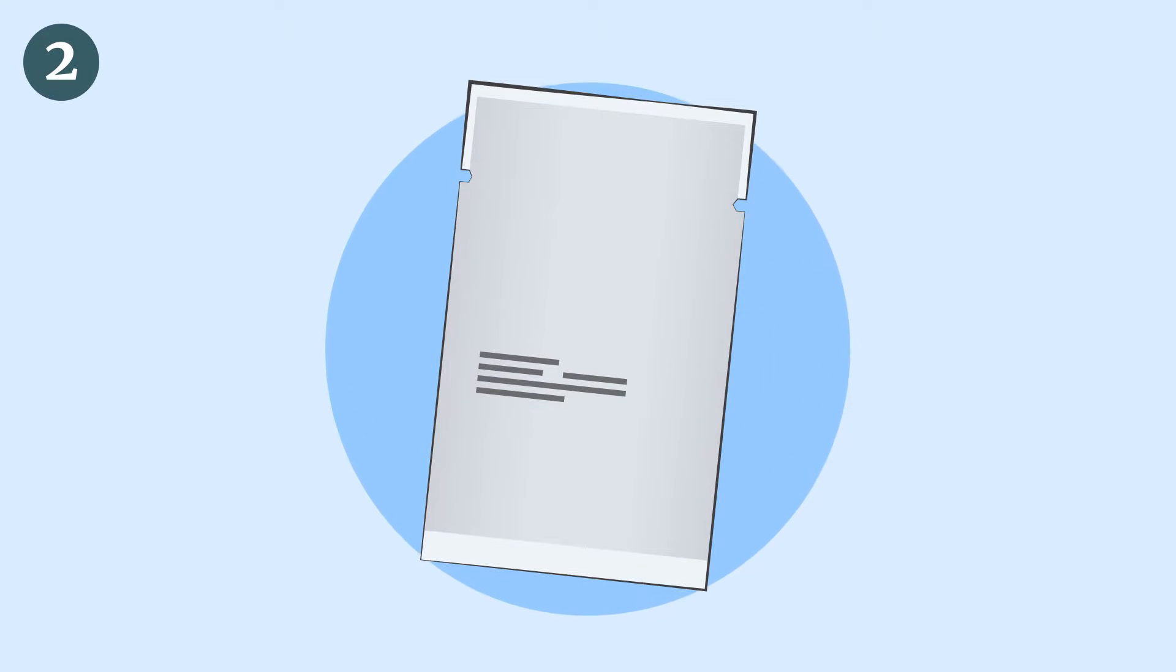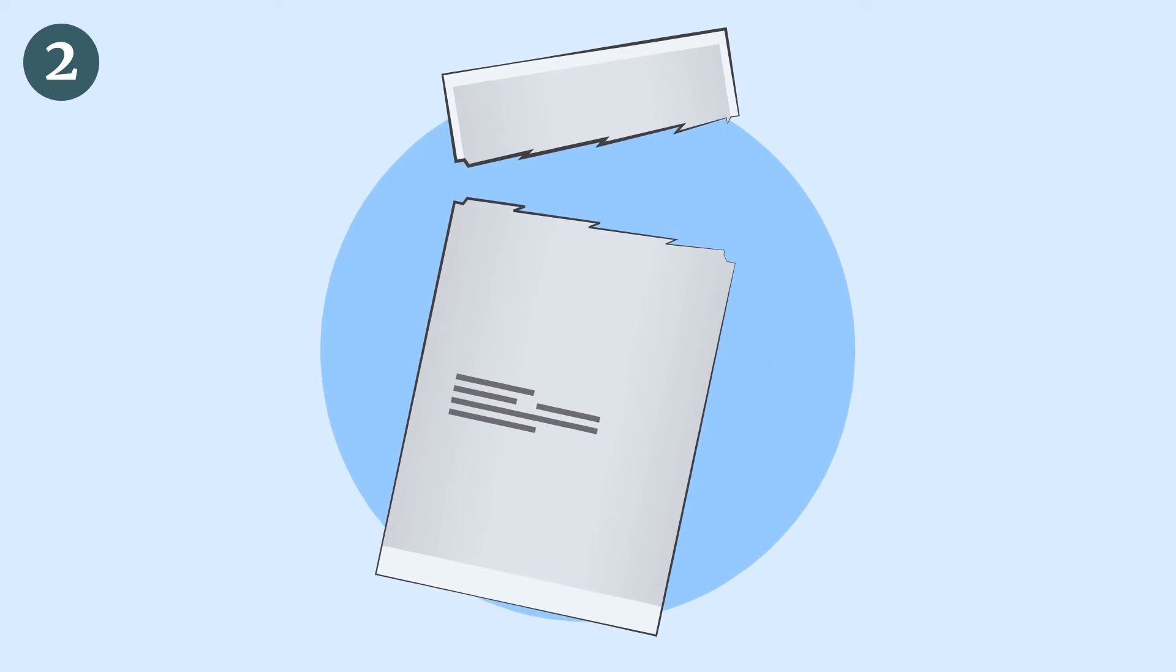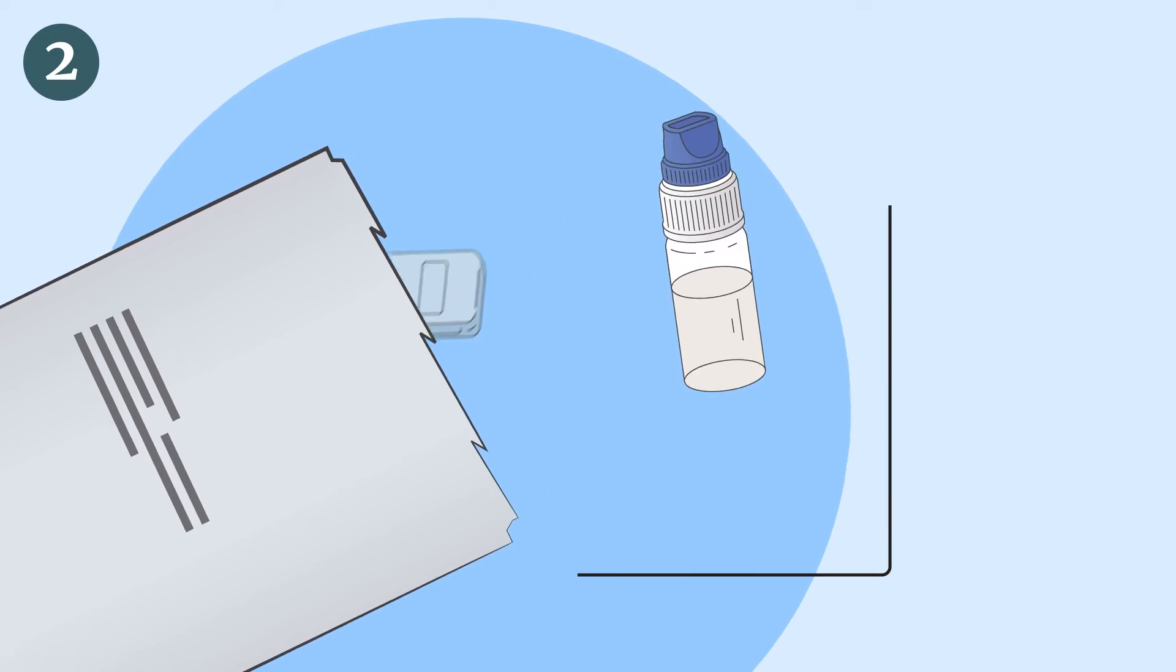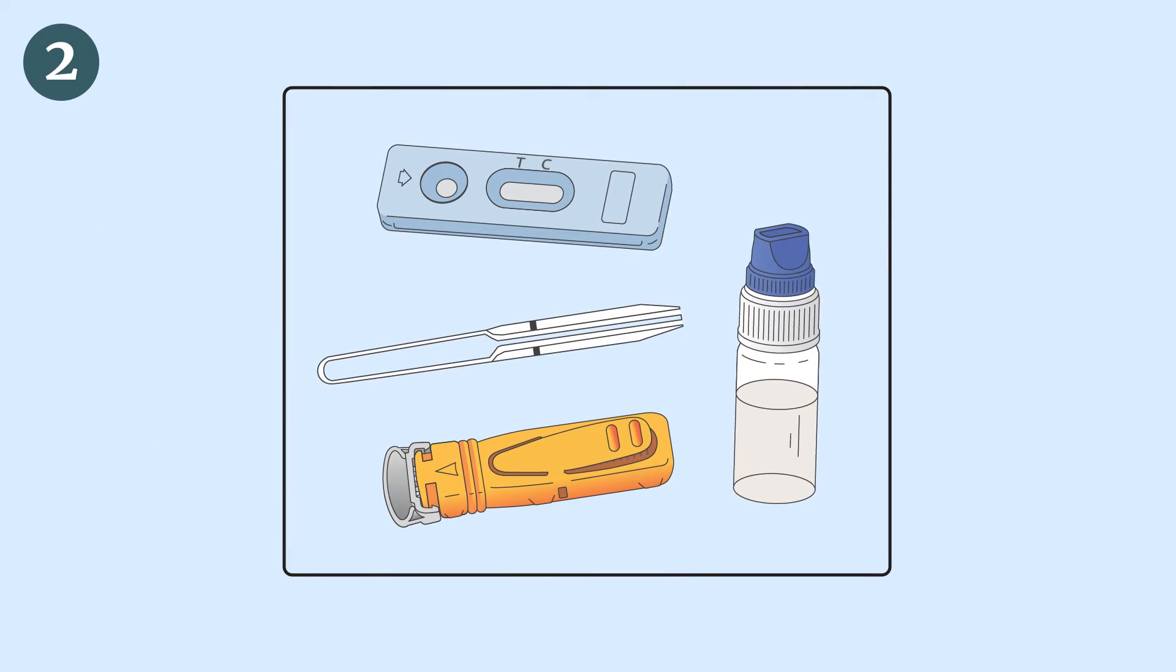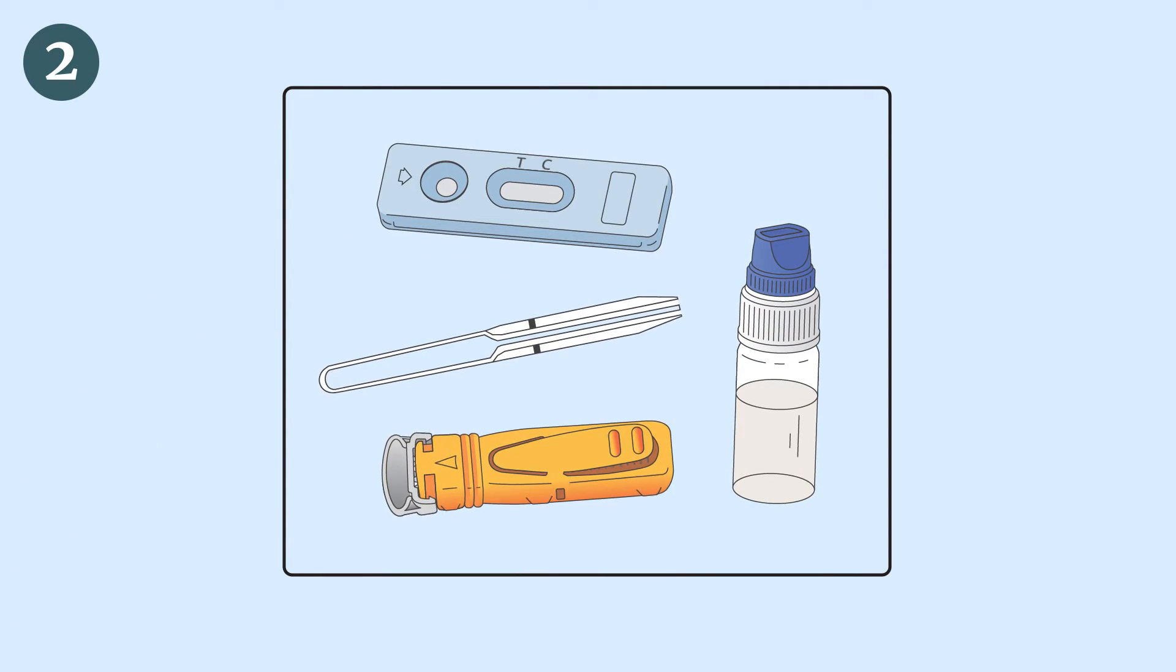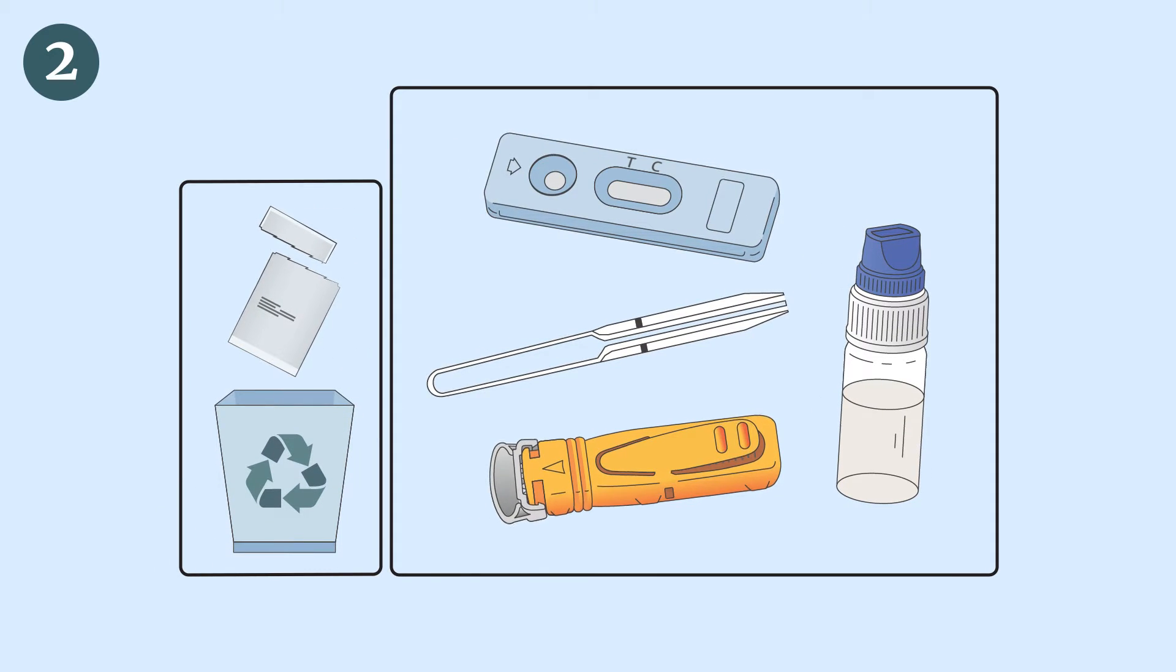Prepare the test device, the pipette, and the dropper bottle by taking them out from the protective pouch and place them within reach of your hands. You will need them later. Discard the aluminum pouch.